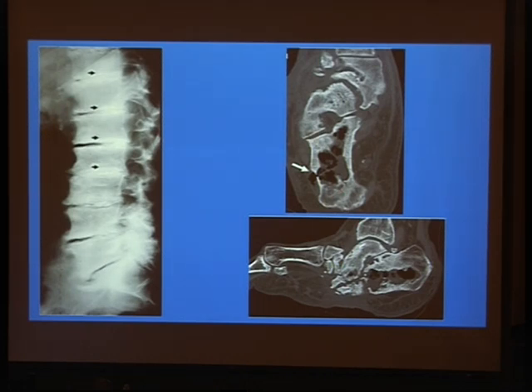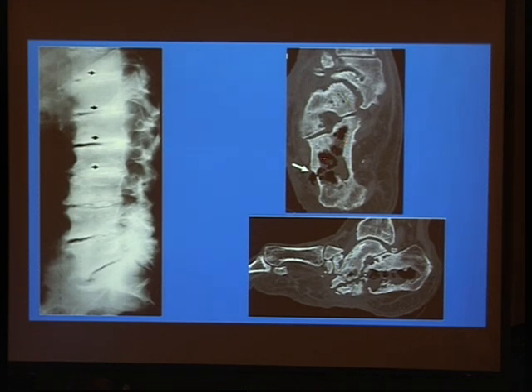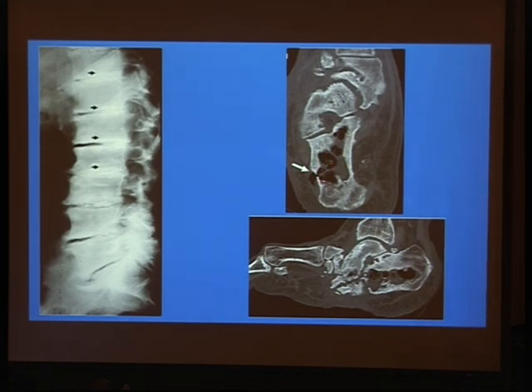This is a case of osteomyelitis also in a patient with long-term hemodialysis — this is the calcaneus bone. We can see a destructive region, aggressive type of infection at the calcaneus, sinus formation, and destruction of the bone. The sagittal image shows the sinus tract and extension of the infection into the adjacent soft tissue around the bone.